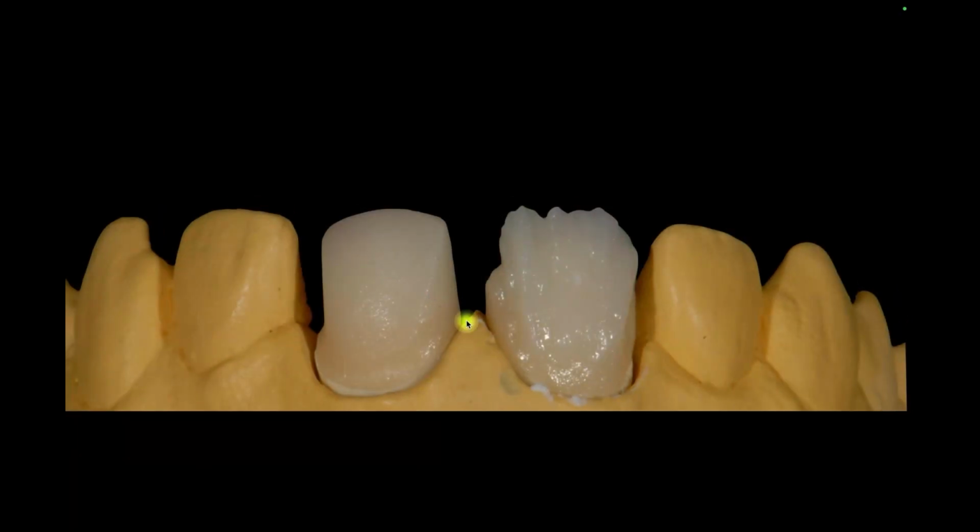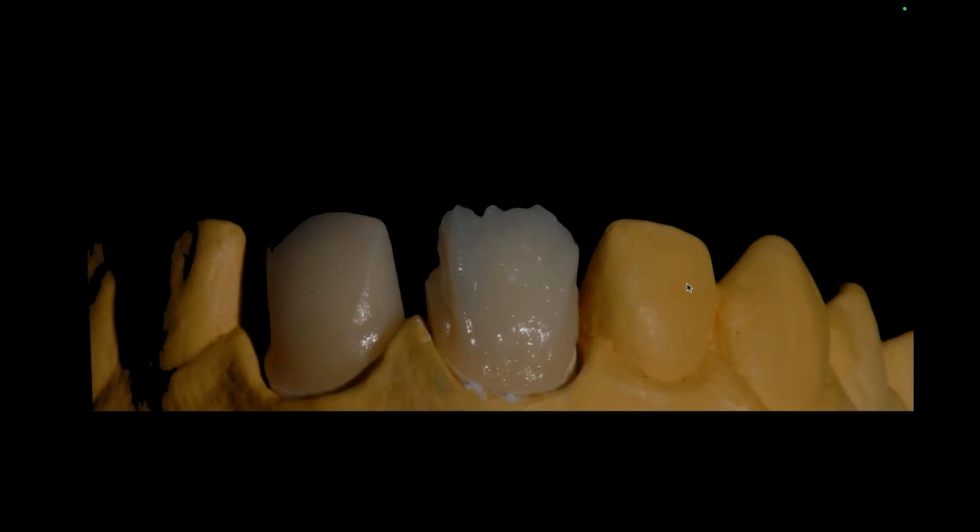And I think you can see right away that my opacious materials are giving me not only density, but kind of all the things that I want. Extra chroma interproximal, less chroma on the facial, value in that middle third, up and down the line angles, and a little lower value towards that incisal third. So that's 4 opacious dentin materials.